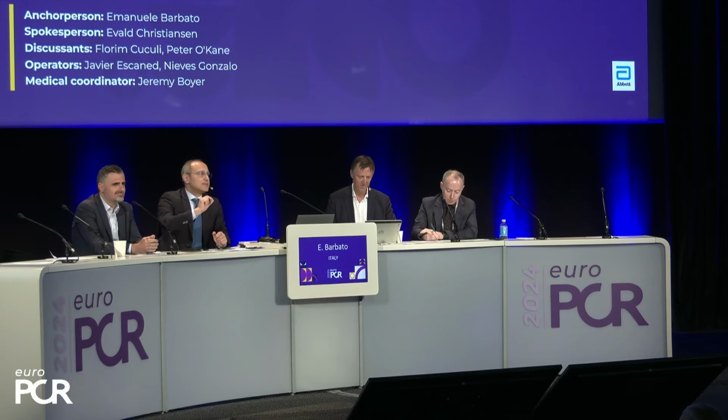But that tells a lot. That means that really we are quite all convinced that this is a left main PCI. Florim, we go back to you. So 2/3 agree with you, 1 stenting strategy, but 1/3 is concerned that we are ending up with a 2 stenting strategy. Your task will be, if we need a 2 stenting strategy, how we are going out of troubles here.